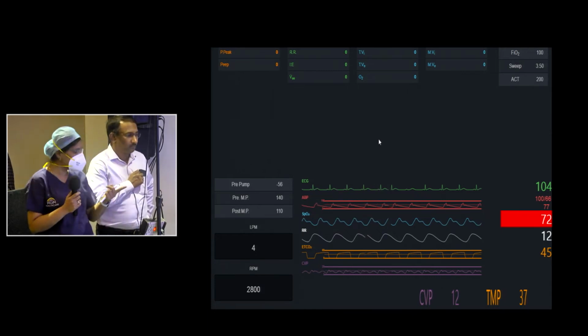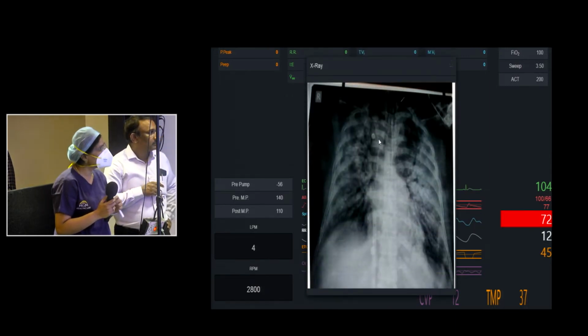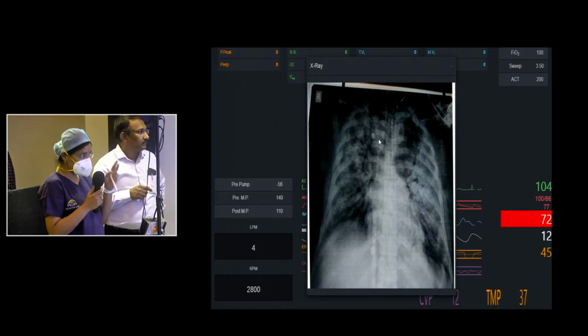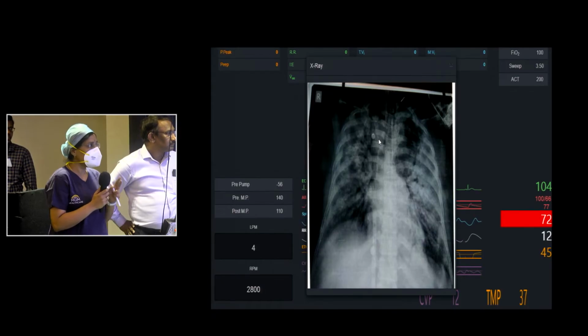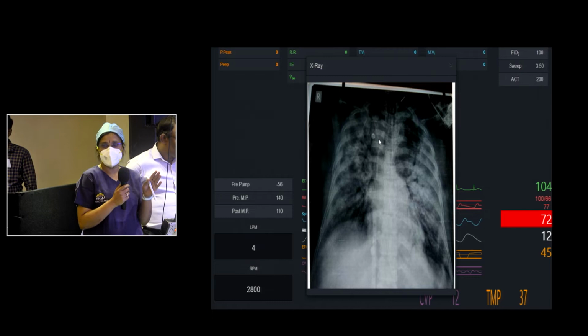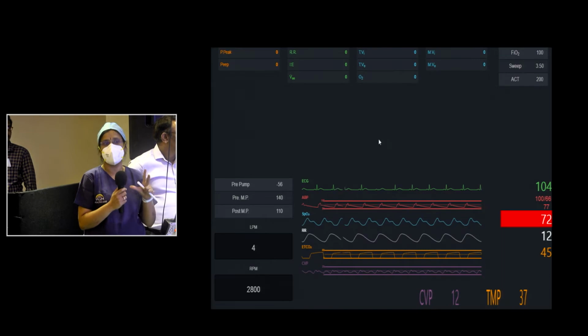Finally, when you are looking at recirculation, this is the cannulas. If you have done the basic troubleshooting, coming to the recirculation part, which is very probable and a very practical thing which happens in day-to-day ECMO situations. What we need to check always is the cannula positions. So ideally what is described is a 15 centimeter gap between the tips of the two cannulas. So 15 is described, like I said before.